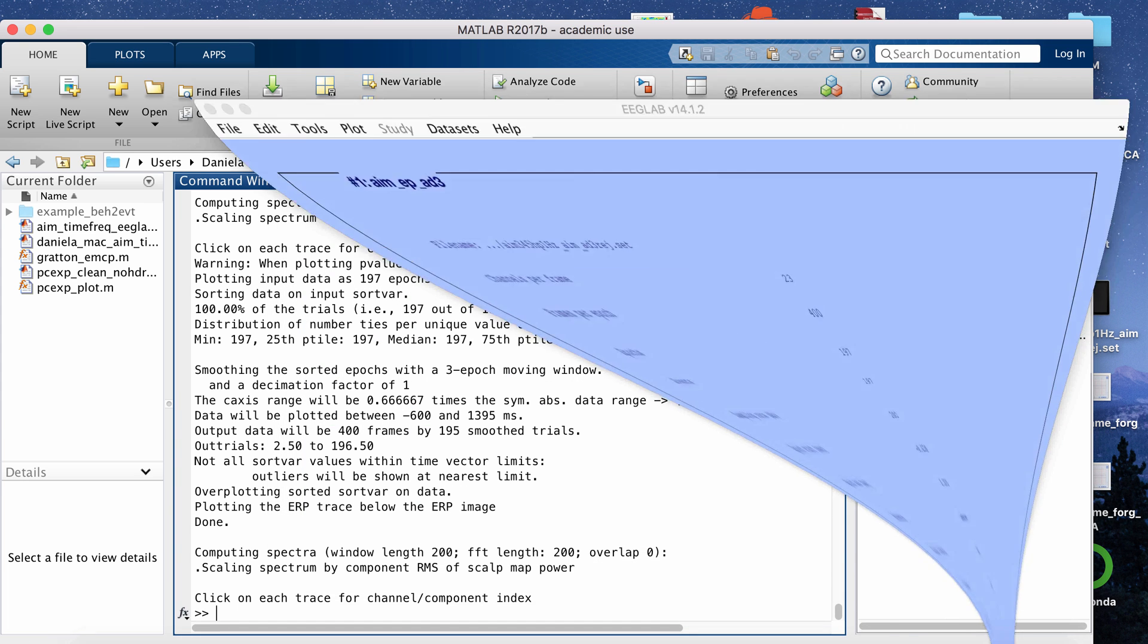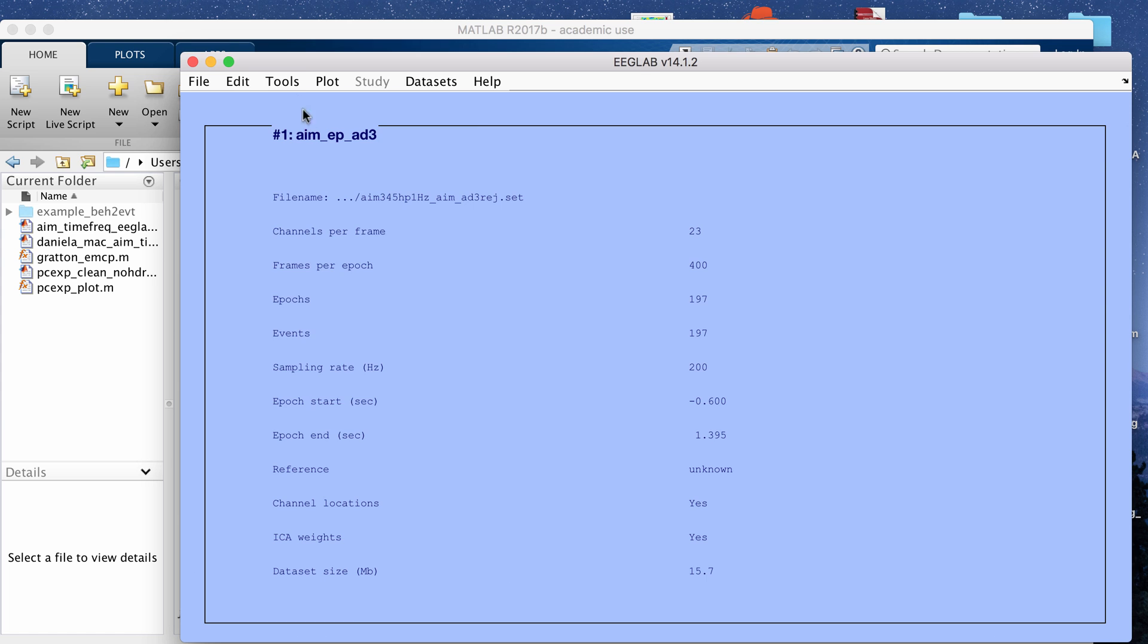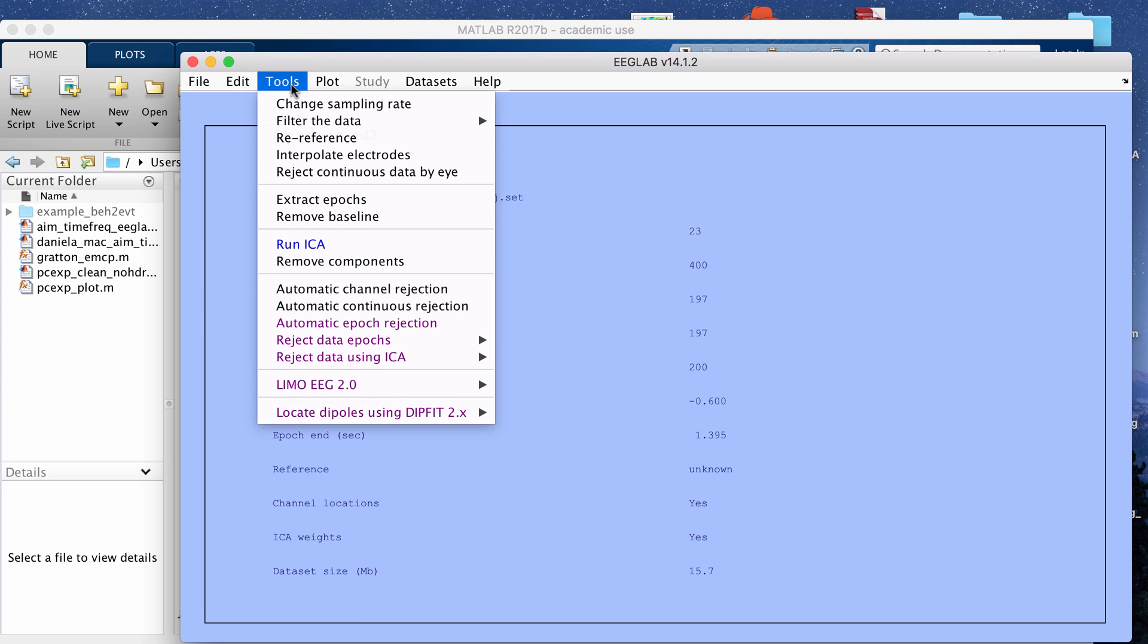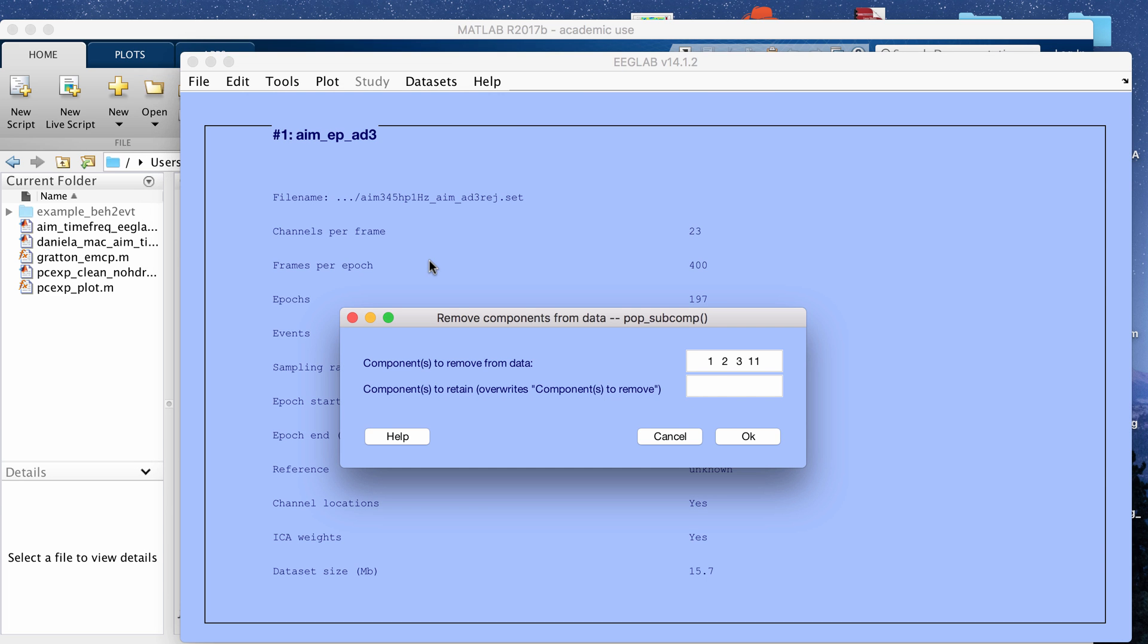Then if I go back to this window, like I said, the components haven't actually been removed yet. To remove components, you want to go to tools and then remove components.